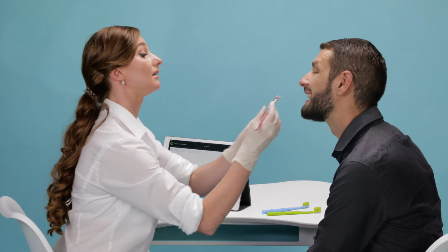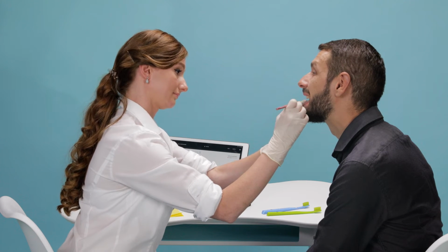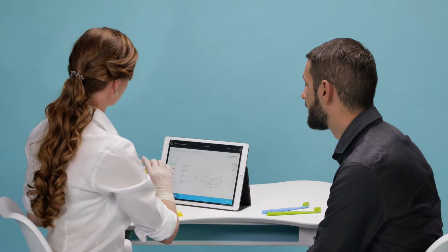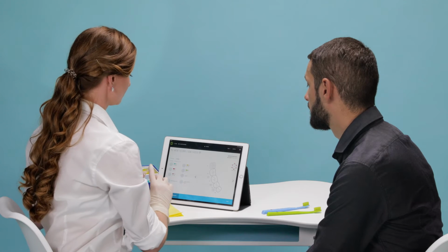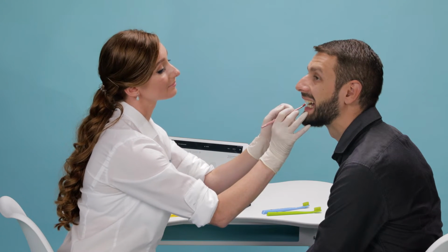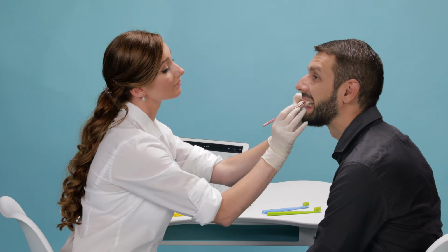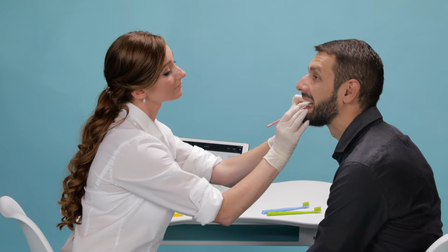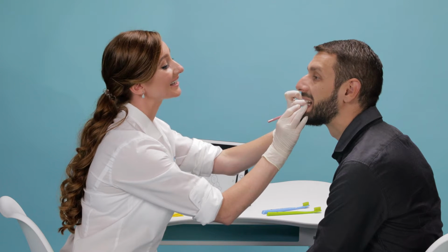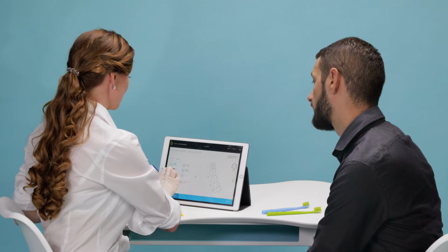When using the IAP on the lower anterior sextant, it clearly indicates the colour turquoise on the probe for each interdental space here. I input this information into Bob by holding down the turquoise button, which then infills each interdental space with turquoise. I complete my full IAP assessment on Edward's lower right sextant.